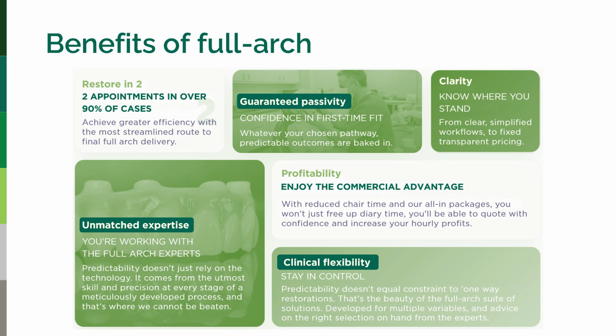The guaranteed passivity through Passivity Plus is a real winner. If you're nervous about ensuring that you've got passivity, this just takes away some of that worry, and it can be fitted to any of the pathways that I've discussed.